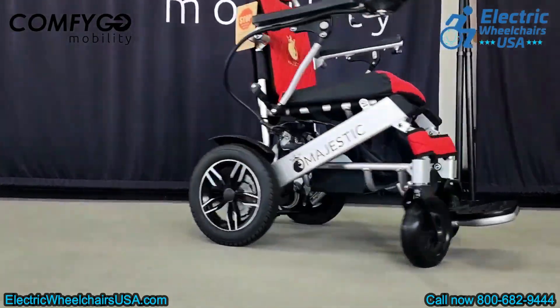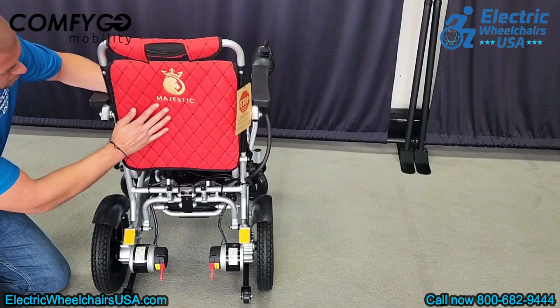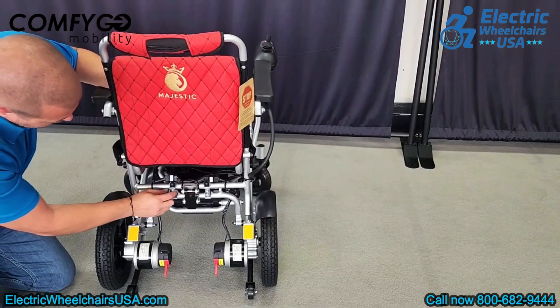The design is sleek and modern. The fabric on this chair is top-notch and truly stands out compared to other foldable power wheelchairs on the market. It's also extremely comfortable.